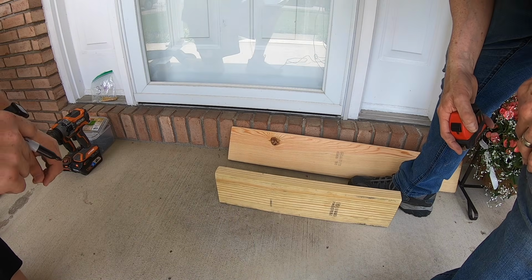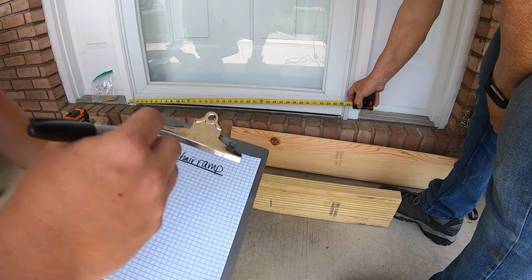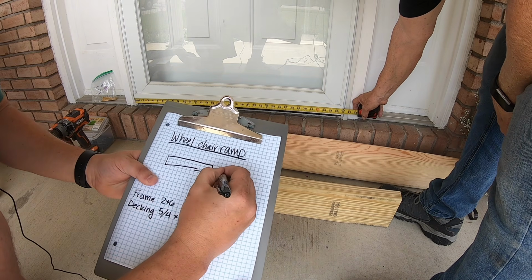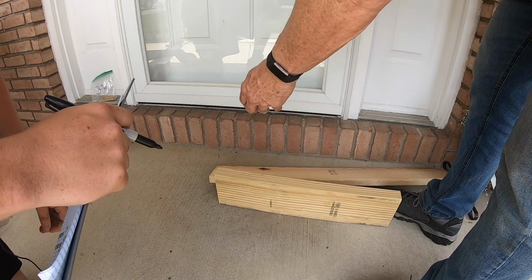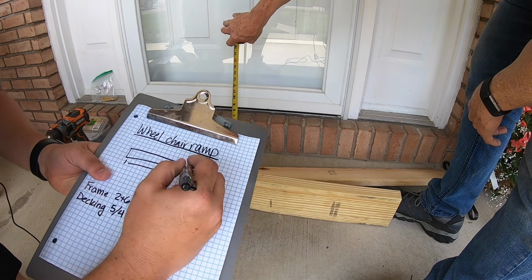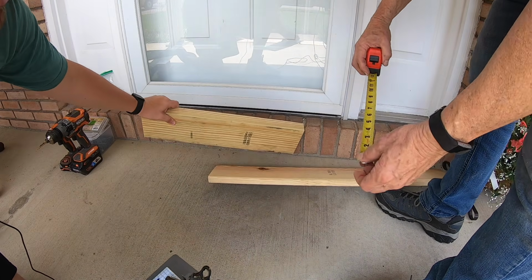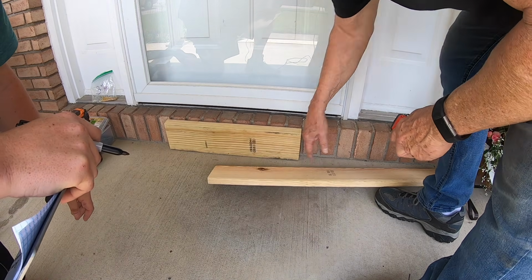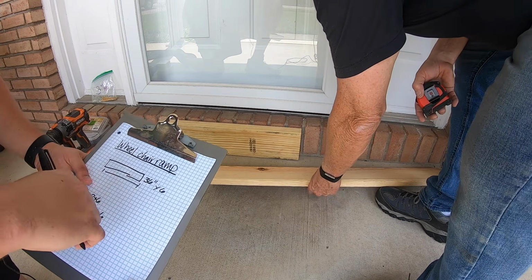So the first thing you're going to want to do is measure the width of the door so we know how wide. This door width is going to be 36 inches. So you know it's 36 inches from here to here. Then we're going to also measure how tall it is as well, and it's right at about 6 inches. So you've got 36 by 6 is what we're looking for. And this is going to be pretty much your framing. And just to give you an idea, it looks like it's just about 1/4 inch off or so from the actual.